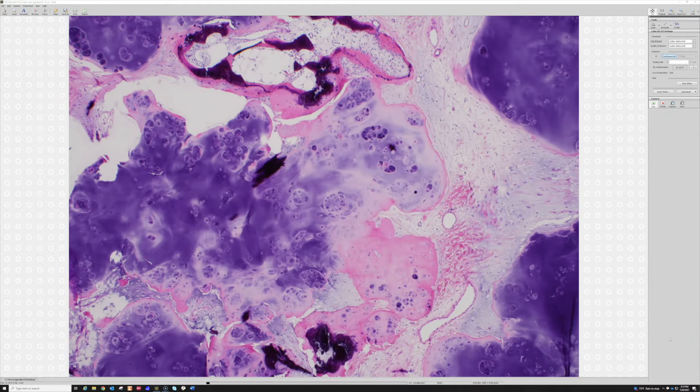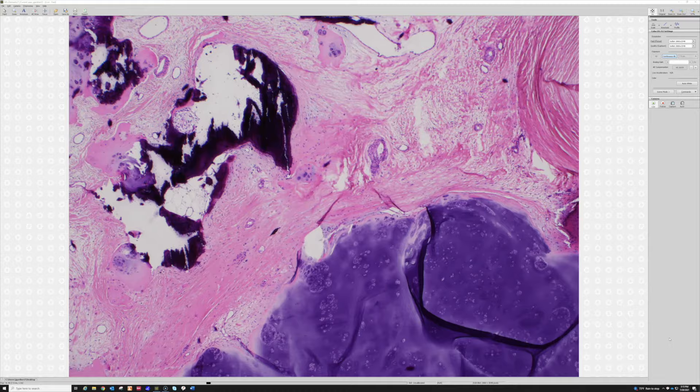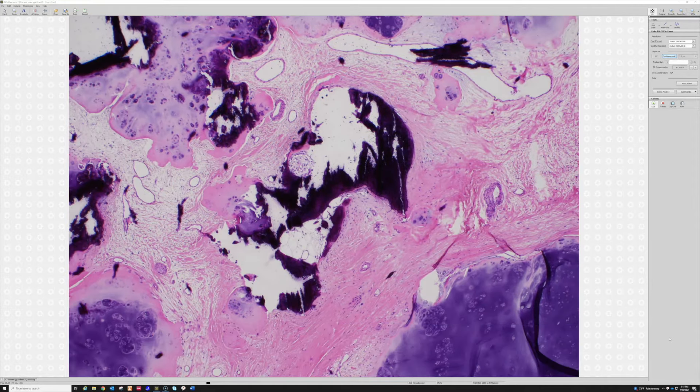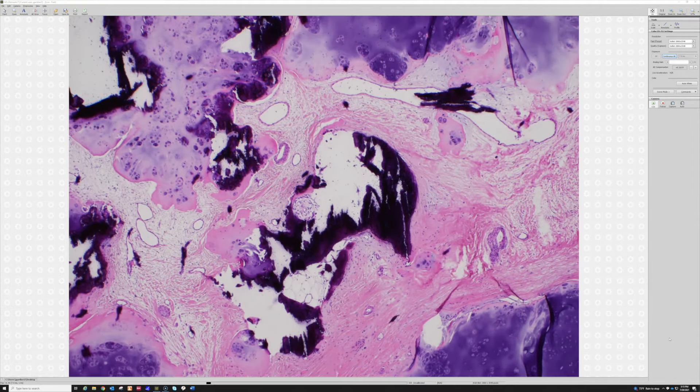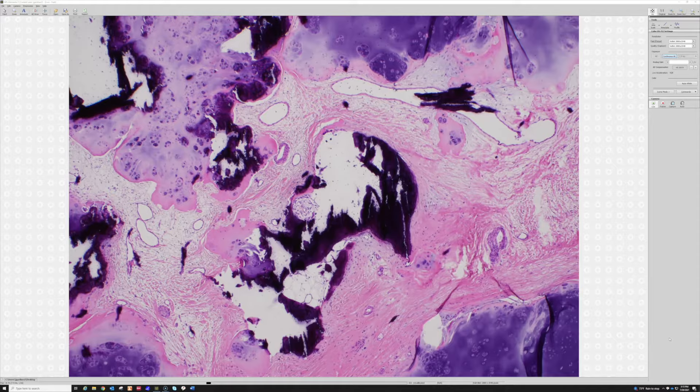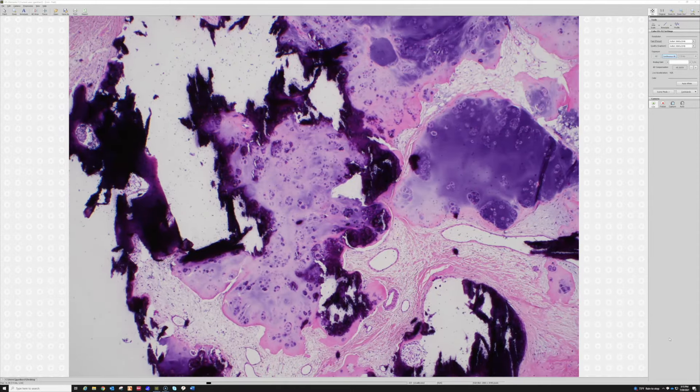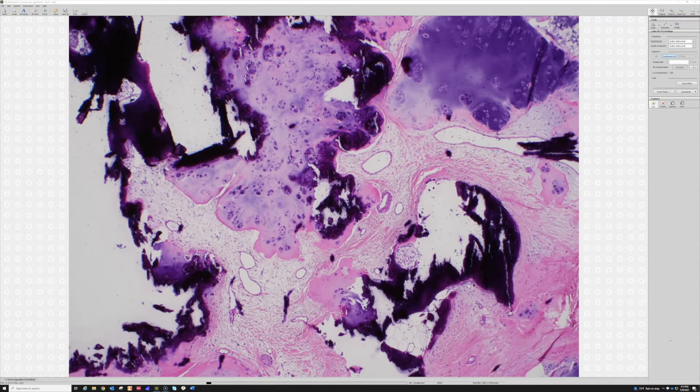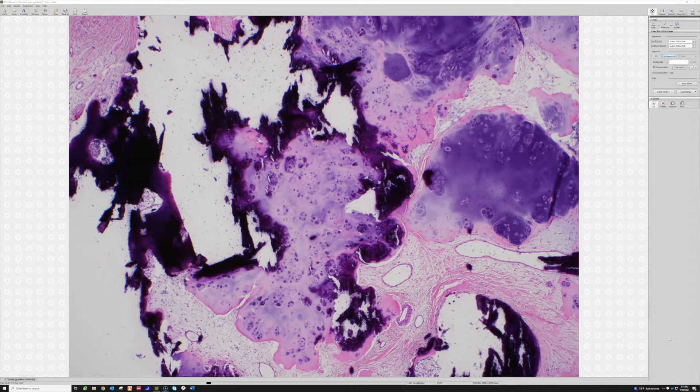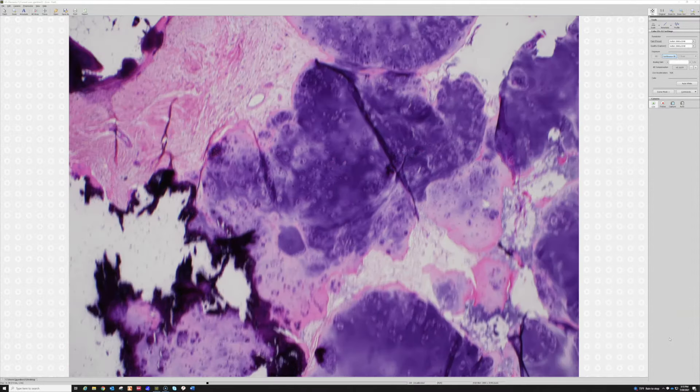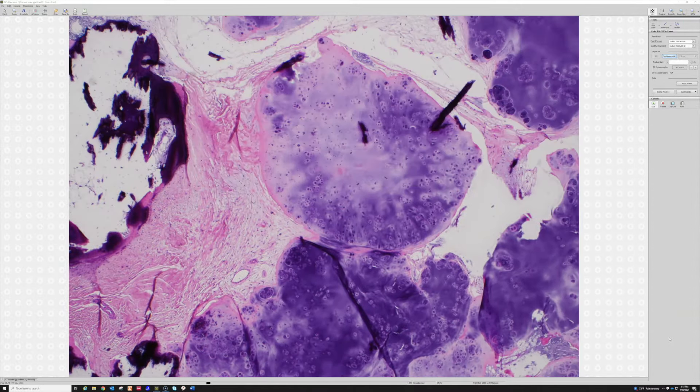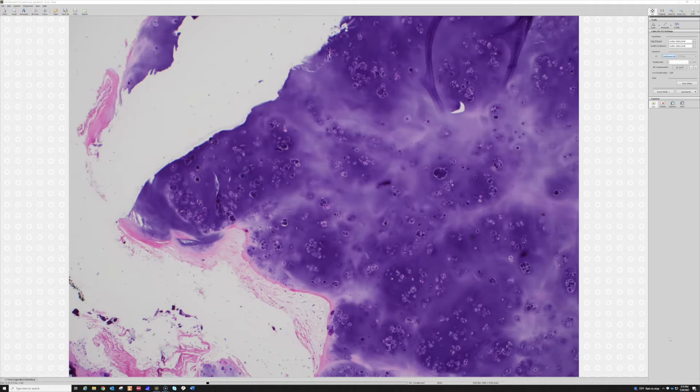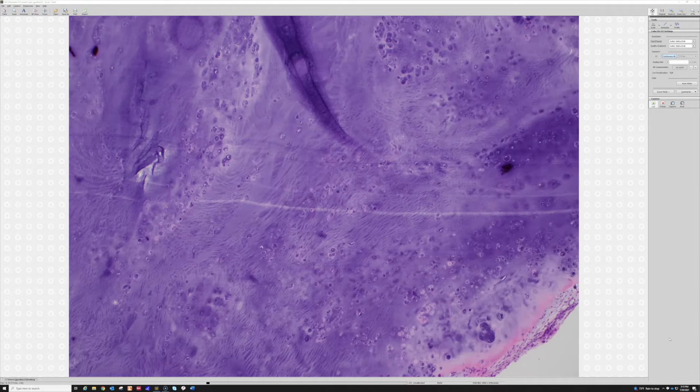But here I'll tell you this is not in the bone, even though it's producing a little bit of bone. And it's not been decalcified - that's why the bone's very purple and fractured. You can see where the bone's coming from: the cartilage itself is actually ossifying. You get a nodule of cartilage and it's beginning to produce some bone. That happens sometimes - cartilage lesions have a tendency to get calcified and ossified.